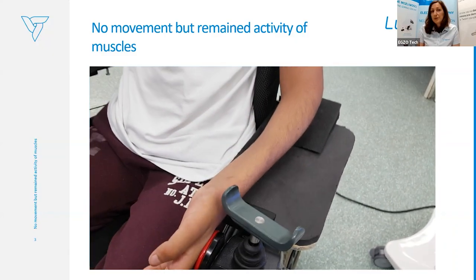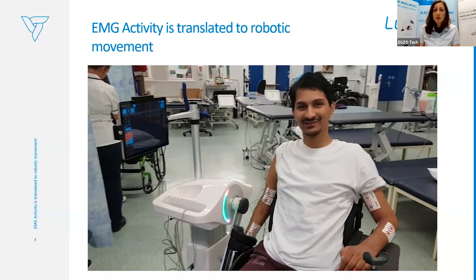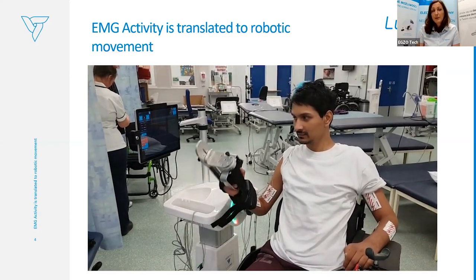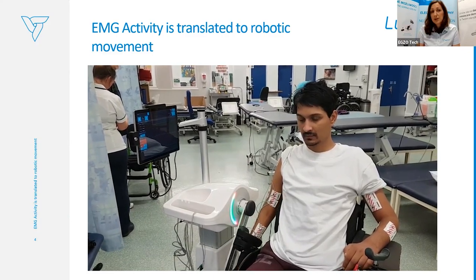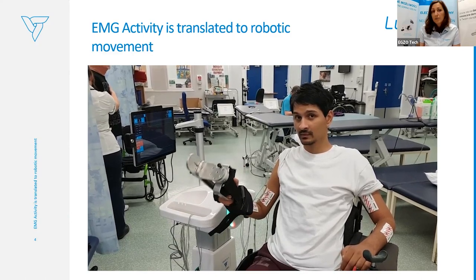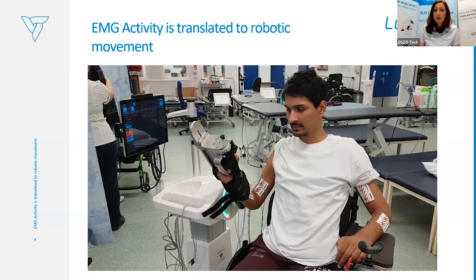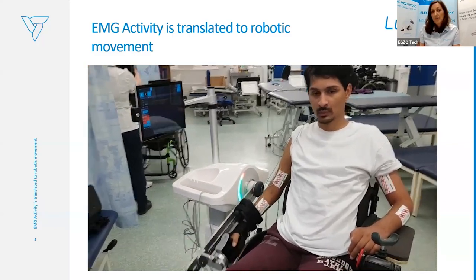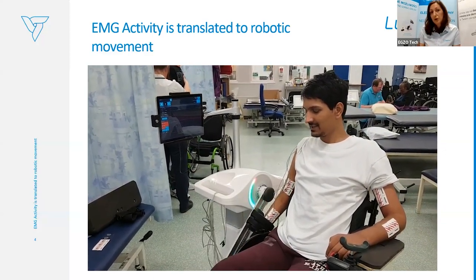Based on this very little activity on the right-hand side, we put the electrodes on the biceps and on the pronator. Based on the biceps signal, Luna EMG detects his really weak muscle activity and assists with the given move. The patient is triggering the movement and Luna helps complete it through the whole range of motion.